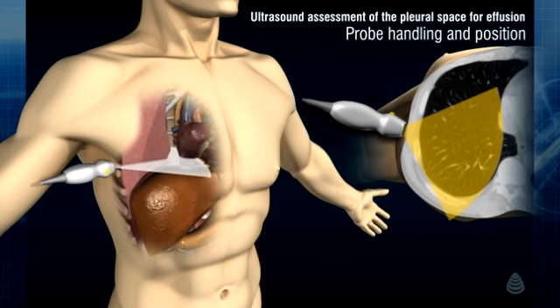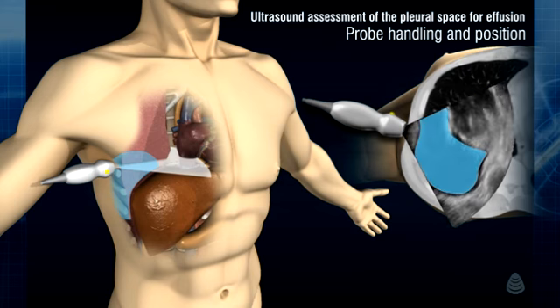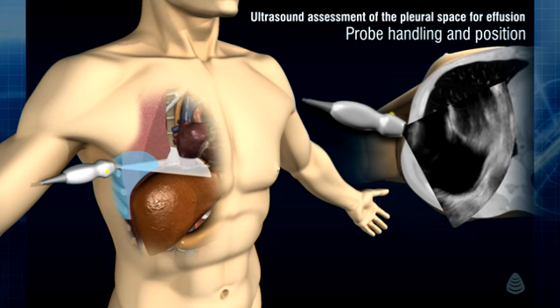In a patient with a moderate right pleural effusion, scanning in the transverse plane just above the liver would show the effusion that could look significant. However, it will not show the liver, which is located just a few millimeters below the plane of imaging.